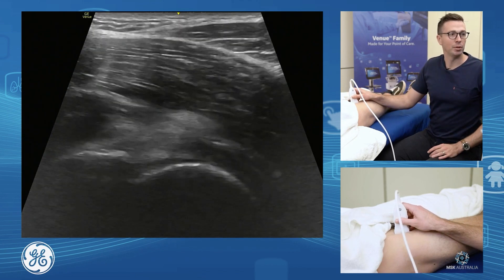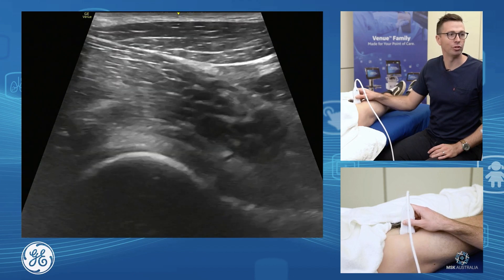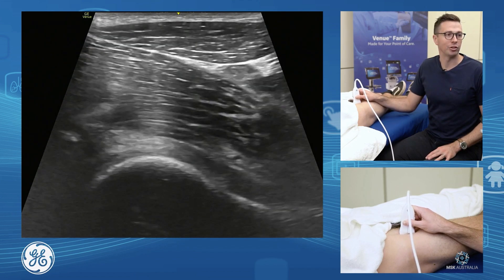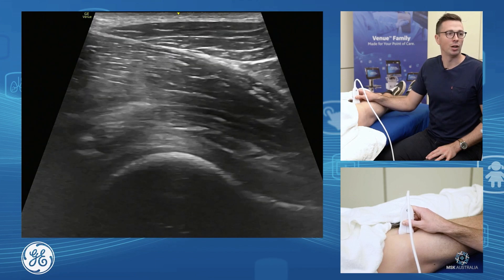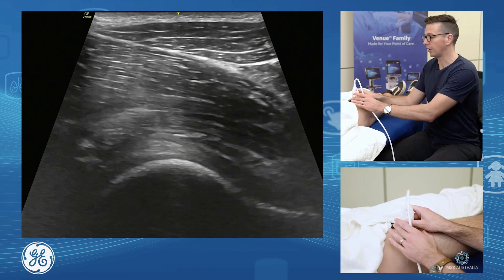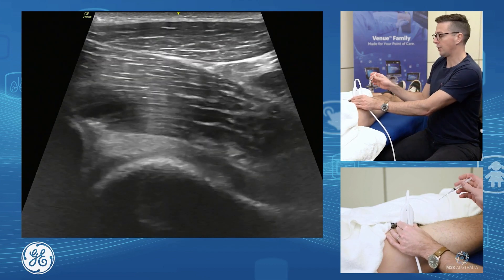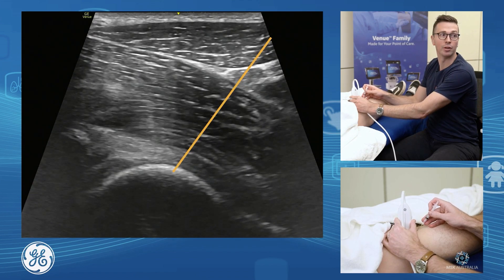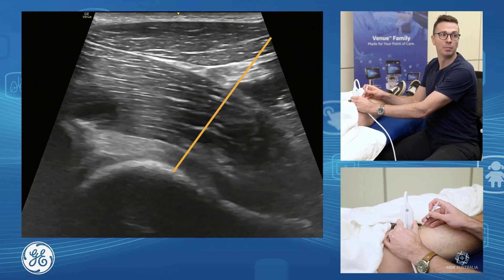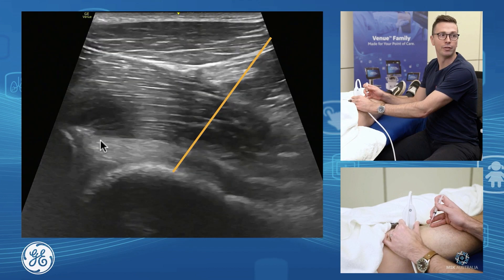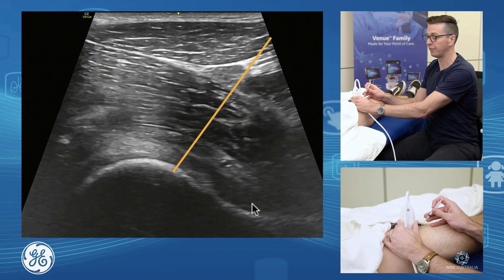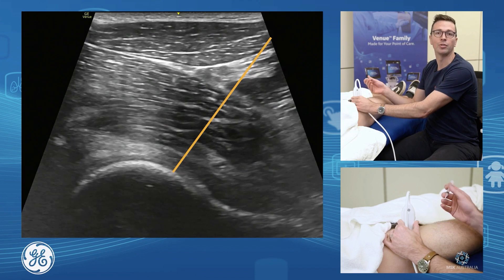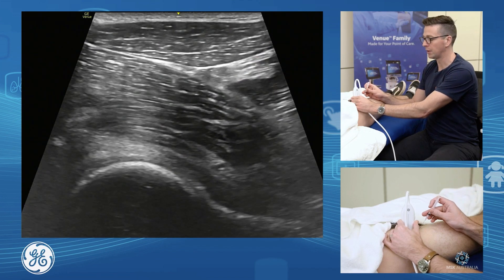For an anterior hip injection or aspiration — if they have an effusion, you want to see what's causing it, assess fluid contents, rule out infection, or inject the hip joint — I like a longitudinal approach. Come in longitudinally from an inferior aspect and bring the needle down through here. We drop down and hit on that head-neck junction. As long as you get anywhere underneath the iliofemoral ligament, you're within the joint. As you inject, you'll see it fill up the space and see that capsule lift off.